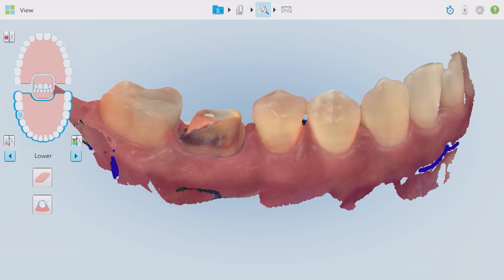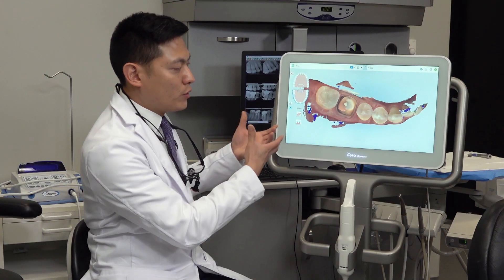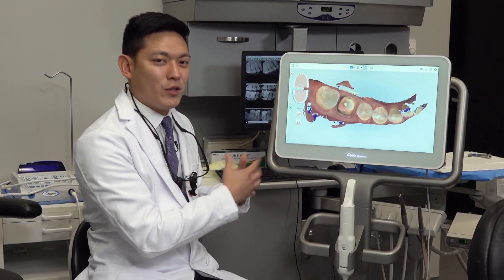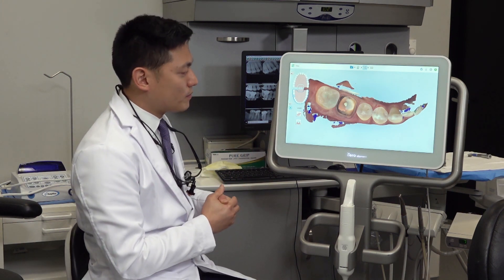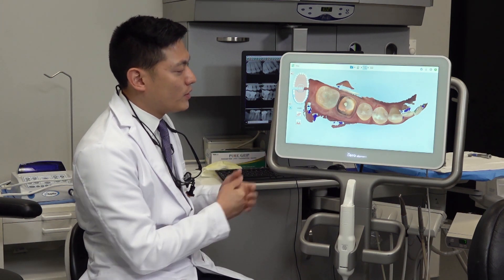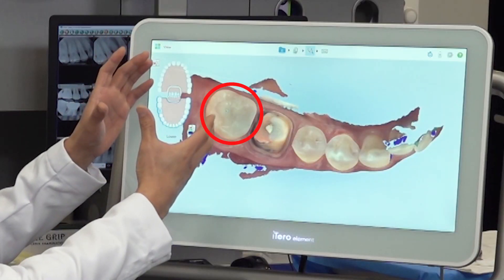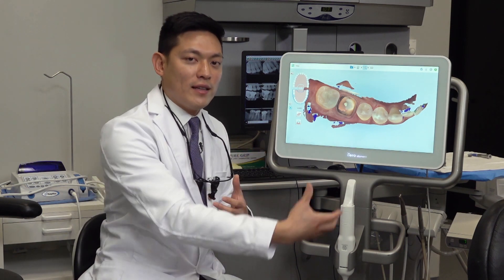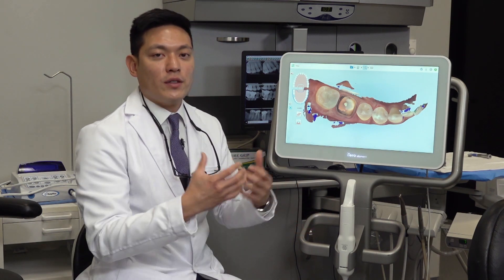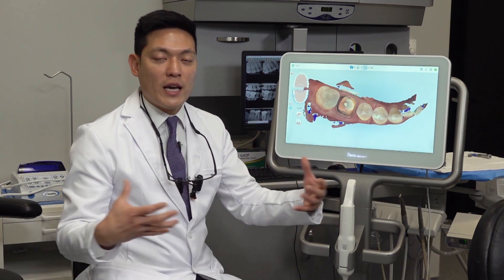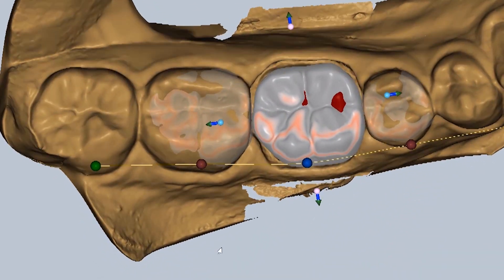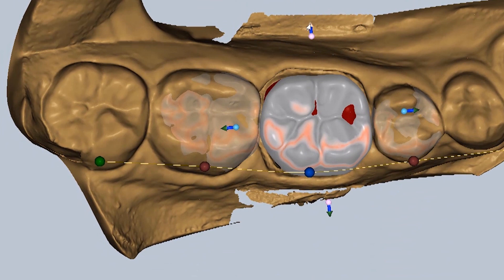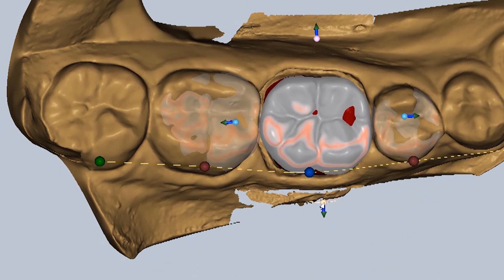Starting off with the entire model, with most of these types of cases — single unit posterior restorations or preparations — we want to scan from the last tooth forward to at least the canine or cuspid, so that you have extra data points for yourself and the dental designer to create anatomy within the restoration that is true to form for that patient.